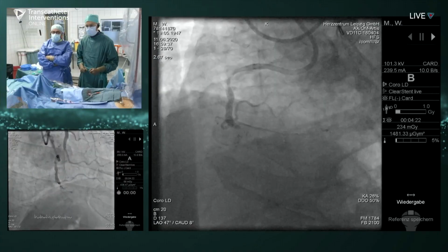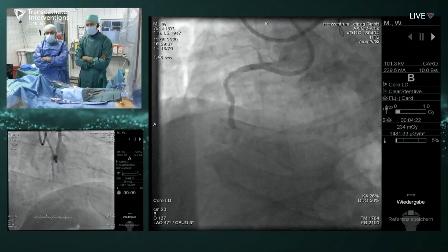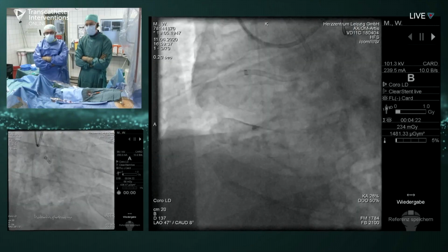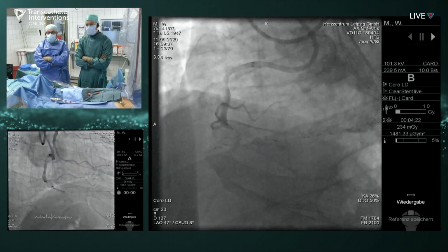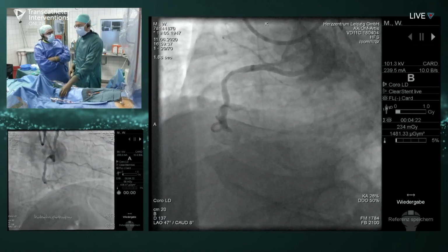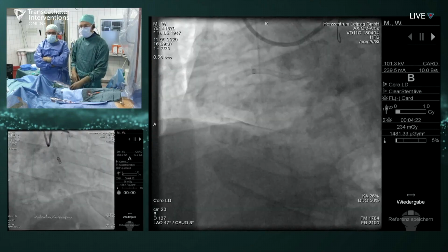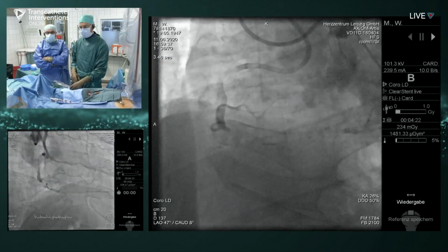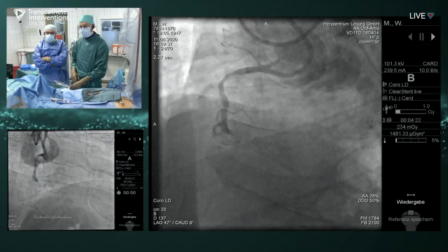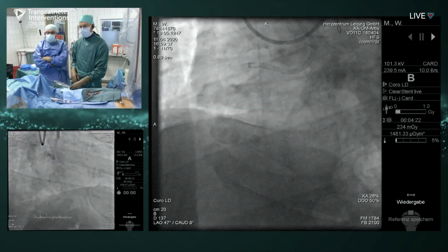Again, the occlusion, the tapered entry into the occlusion segment, which begins somewhere between segment 2 and segment 3. And again, you see the vessel at the bifurcation. It appears a little bit long, but it could be shorter. So I think, and we may discuss this, our initial approach would be a standard antegrade approach using wire escalation. We discussed whether, if this failed, we would do subintimal tracking entry, but we wouldn't prefer this because of the localization of the distal cap near the bifurcation. So probably if we fail antegradely, we will rather swiftly switch to a retrograde approach.